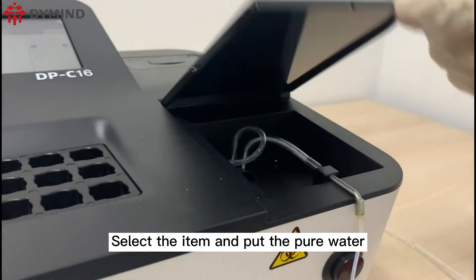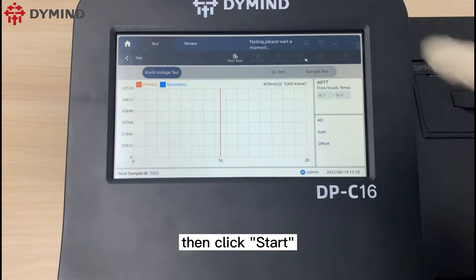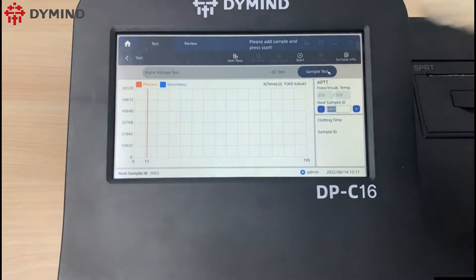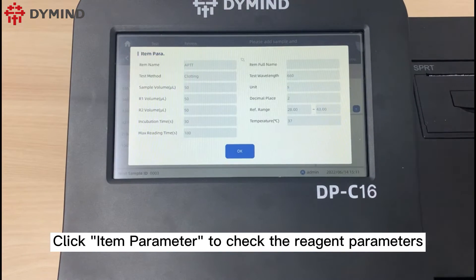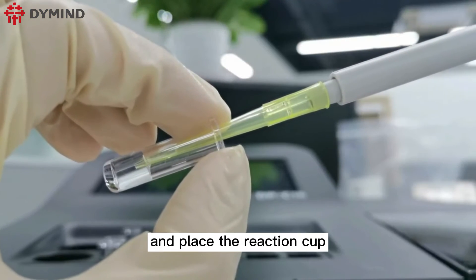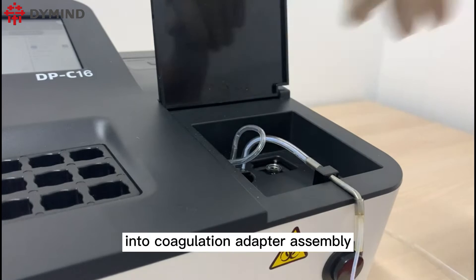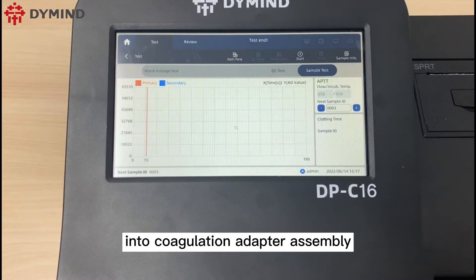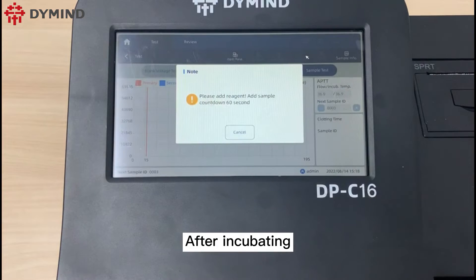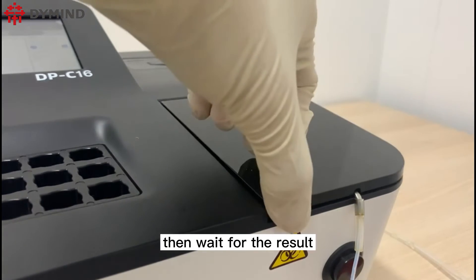Select the item and put the pure water into the coagulation adapter assembly, then click start. Click item parameter to check the reagent parameters. Please put the first reagent into the sample and place the reaction cup into the incubation bath for several seconds, then put the mixed sample into the coagulation adapter assembly. Click start and wait for 30 seconds. After incubating, please follow the instruction to add the second reagent into the reaction cup, then wait for the result.